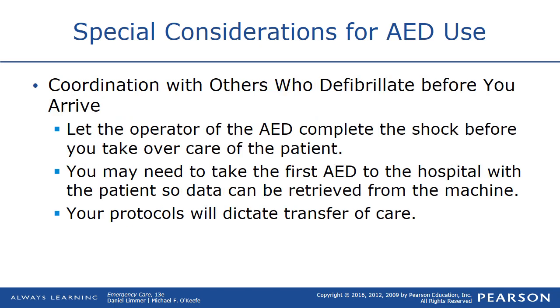Coordinate with others who defibrillate before you arrive. Let the operator of the AED complete the shock before you take over care of the patient. You may need to take the first AED to the hospital with the patient so data can be retrieved from the machine. This is not the case in our situation. Your protocols will dictate transfer of care.